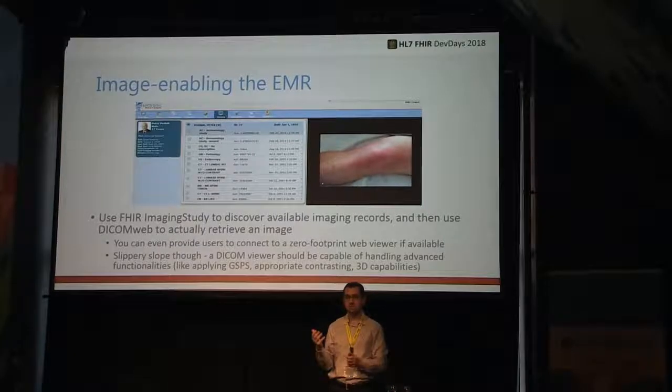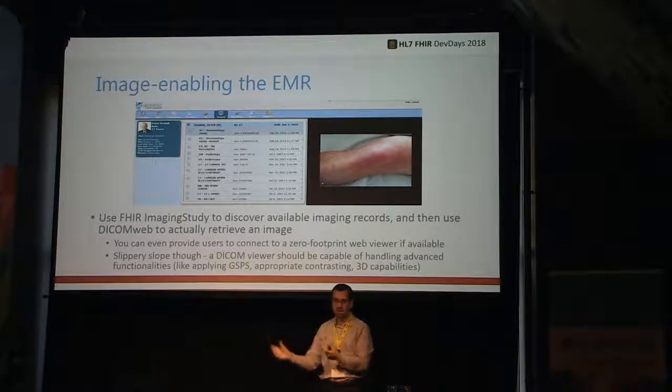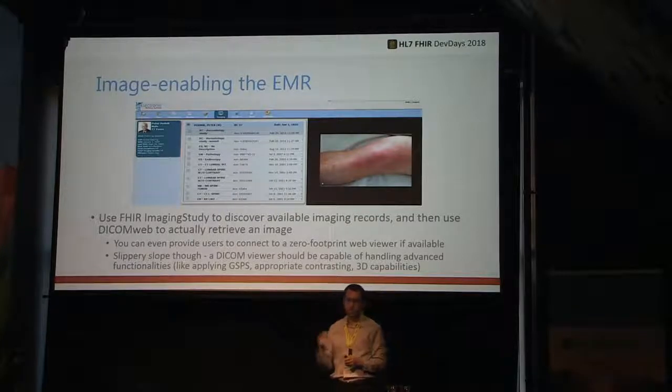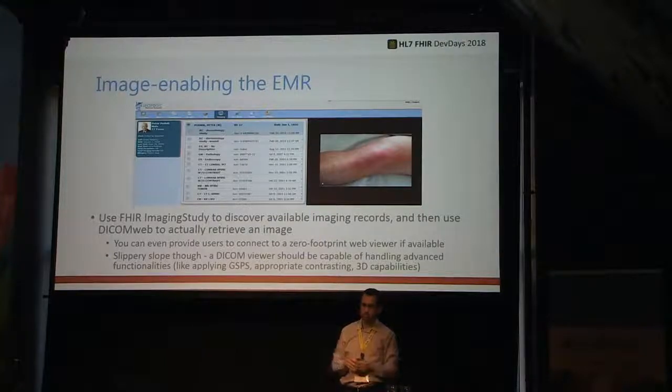A lot of the time, these images are actually captured in 12 bits or even 16 bits. So it's really nice that you preserve that fidelity and then be able to show it. And of course, there are other things too that go into play. I'm not going to bore you with all the technical details, but there's a lot more to those binary images than just pixels. If it was pixels, it would have been an easy problem to solve, and we probably would have never needed DICOM.